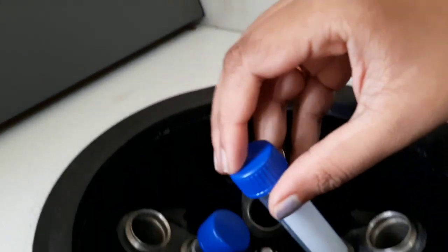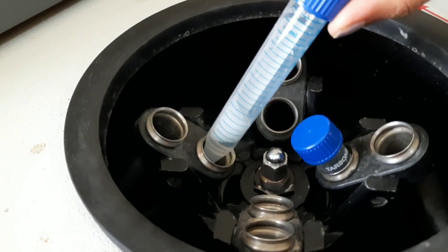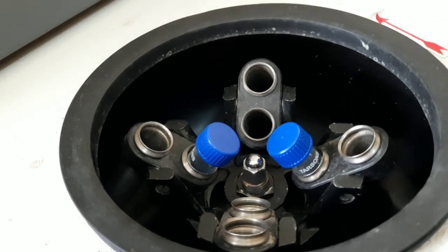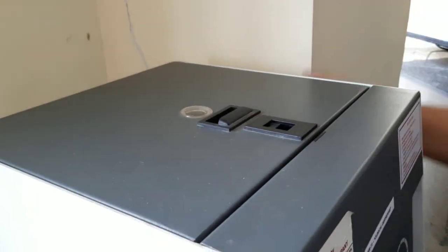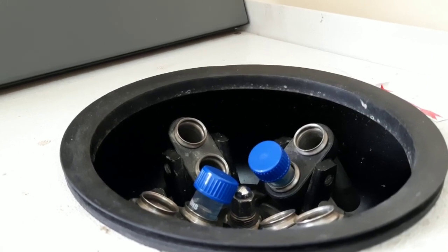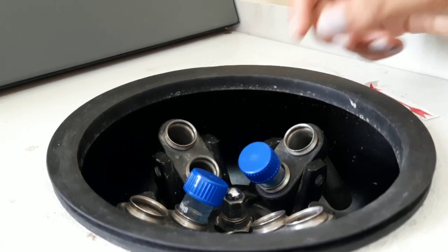You can now see that there is no pellet formed. This is before centrifugation. Now we are going to place this tube for centrifugation in a centrifuge machine. To balance the machine, we are going to use another tube containing distilled water. We are going to close it and perform the centrifugation. Now we have completed the centrifugation process. The RPM was 4000 and for 10 minutes we have centrifuged it.